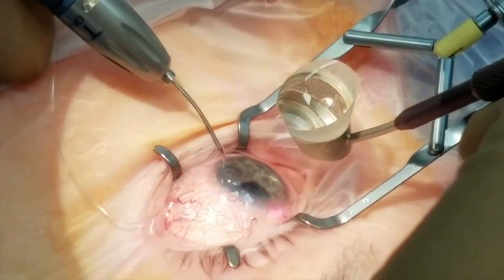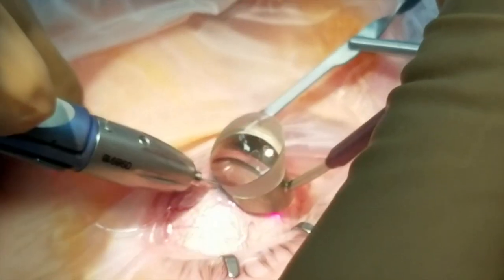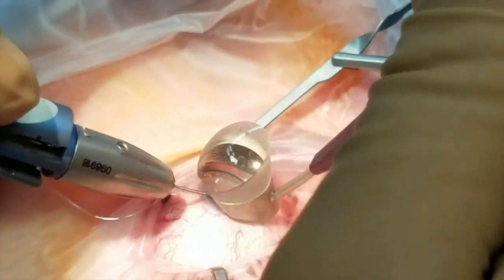A 27 gauge half-inch needle is then used to slightly score over the anterior trabecular meshwork, and you saw how I pulled down a little bit on the TM to expose Schlemm's canal. MST forceps are then used to guide the iTrack catheter into the canal, either from the external approach or internal approach, as you see there.